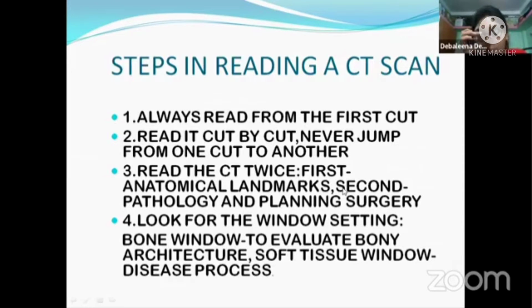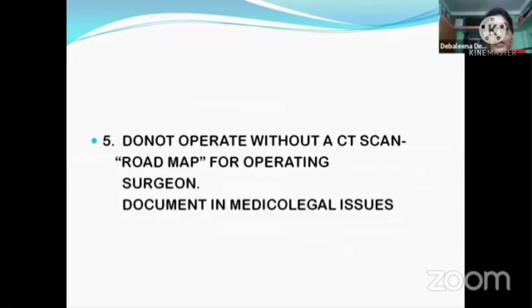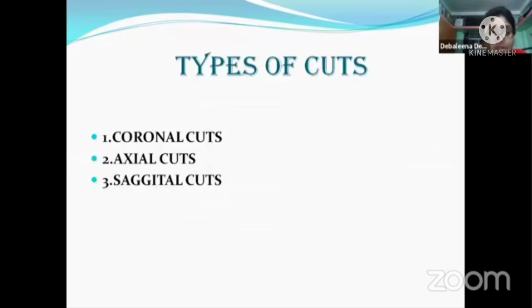We should also look at the window setting: the bone window setting to evaluate the bony architecture, and the soft tissue window setting to evaluate the disease process. We should never operate without a CT scan. Firstly, because it acts as a roadmap for the operating surgeon. And secondly, these days doctors come within the Consumer Protection Act, so it is an important document in medico-legal issues.